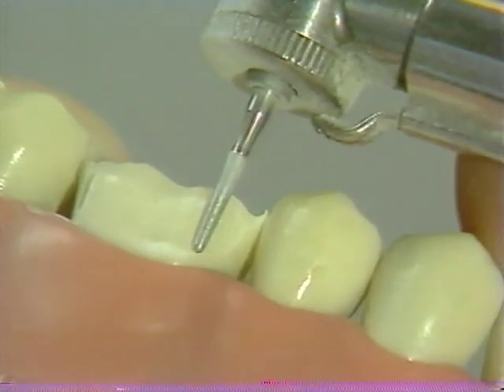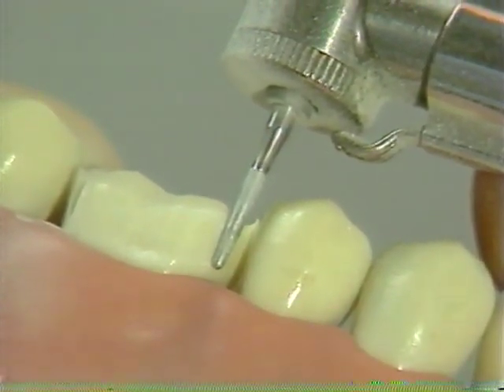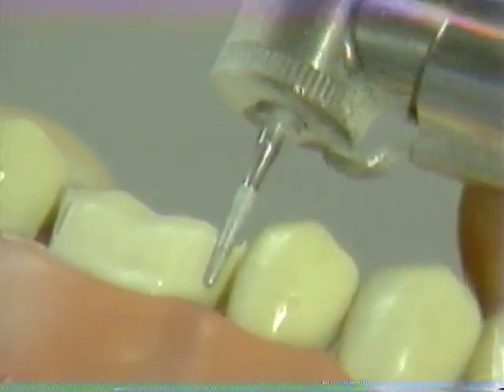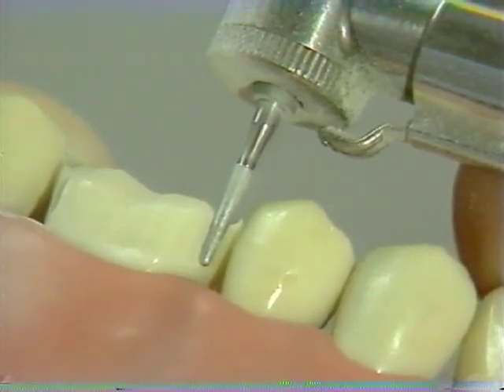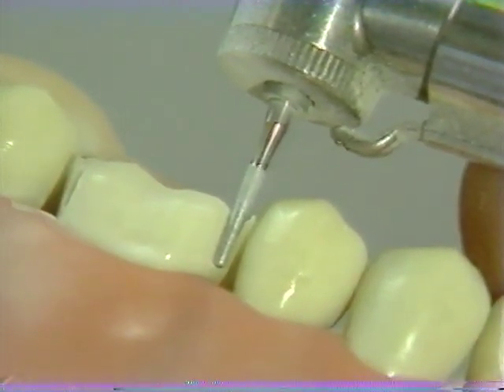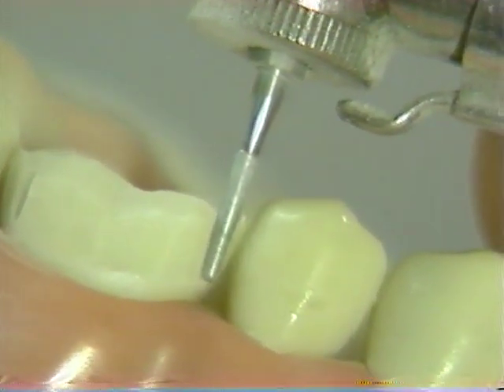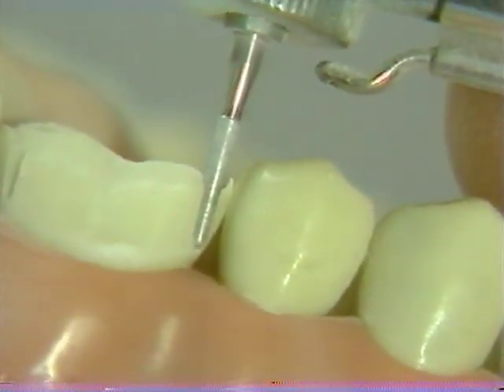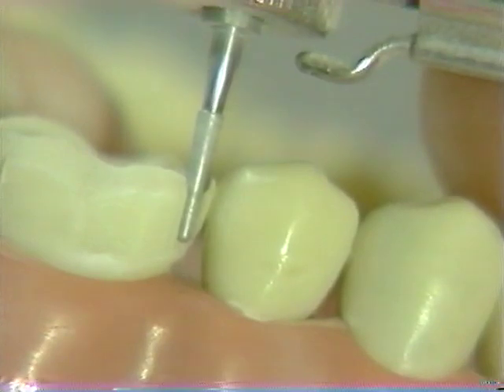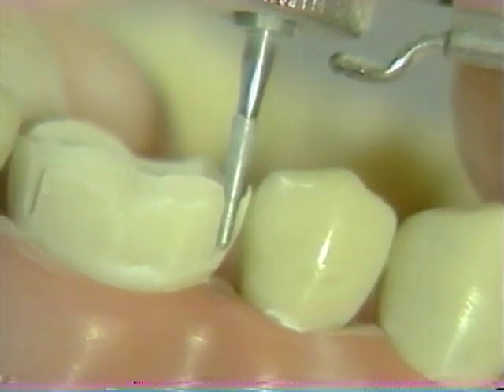Note that sufficient time is allowed for the rotary instrument to create space for itself, and in one continuous motion, the diamond is carried from the central to the mesial buccal depth groove. In the interproximal area, more tooth structure needs to be reduced, so the movement may be somewhat slower. The rotary instrument is then carried all the way through the proximal surface, and in this manner, clearance is obtained.